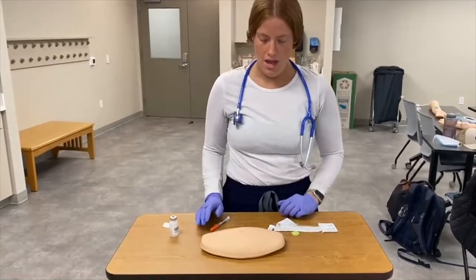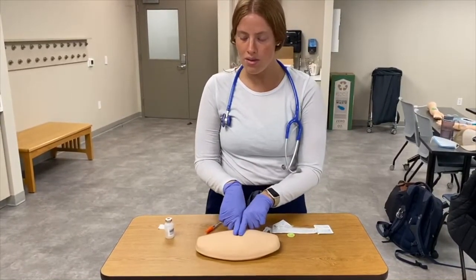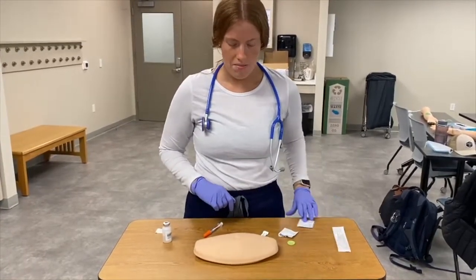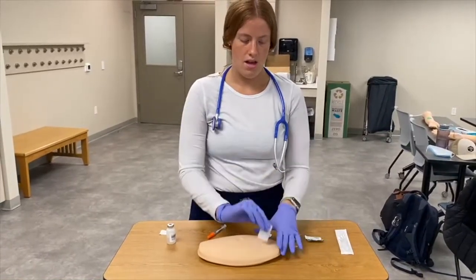I'm going to use a site on someone's stomach. You can also use the back of the arms or any fatty area. You want to avoid doing the injection right near the belly button or umbilicus — I usually aim for at least an inch around it. Once I pick my site, I'm going to clean it with an alcohol swab.